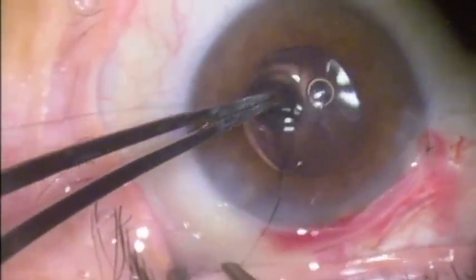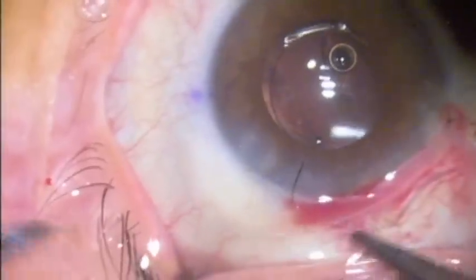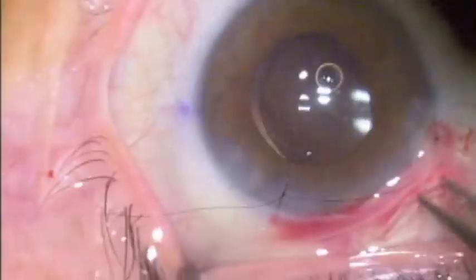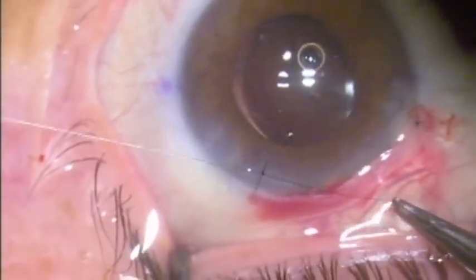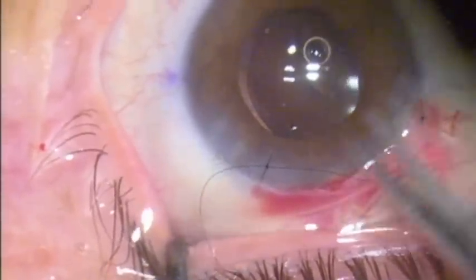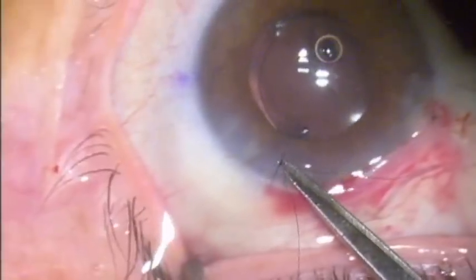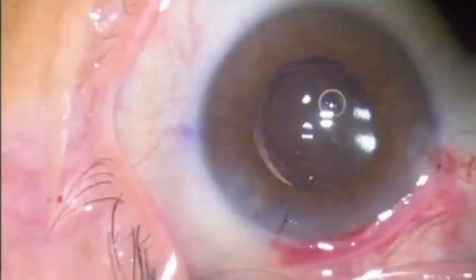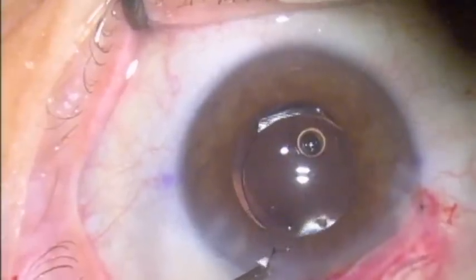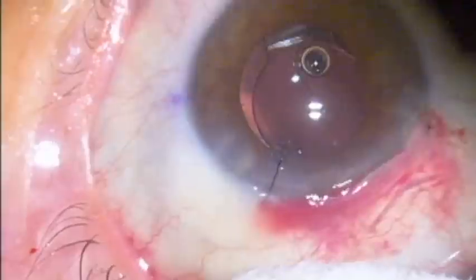After completing this suture, the knot is buried and the surgery is complete. The next day, the patient's vision was 20/25 plus 2 uncorrected with about a quarter diopter of astigmatism, and she was very pleased with this outcome. The implant was in excellent condition and excellent position, arched posteriorly without any evidence of any folds or stria in the posterior capsule.